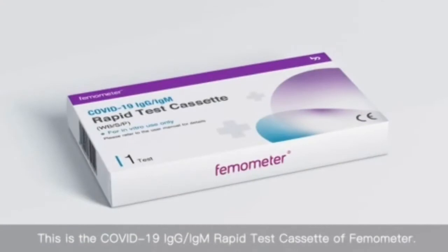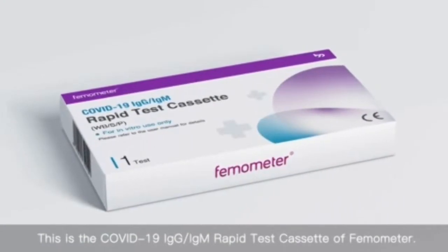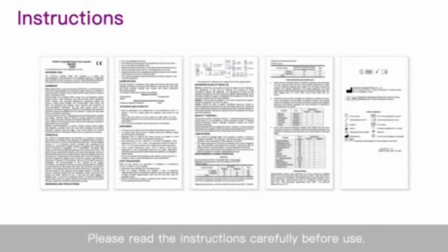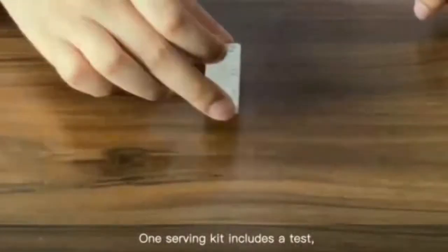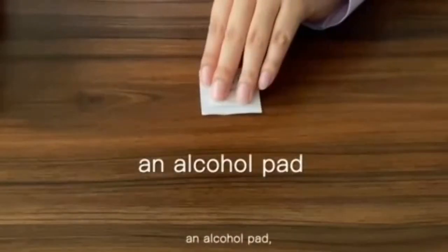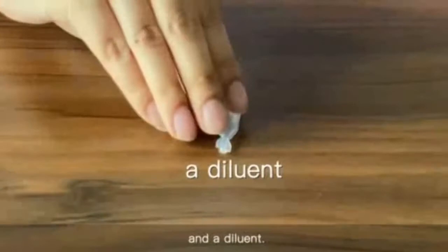This is the COVID-19 IgG-IgM rapid test cassette. Please read the instructions carefully before use. One serving kit includes a test cassette, an alcohol pad, a dropper, a needle, and a diluent.